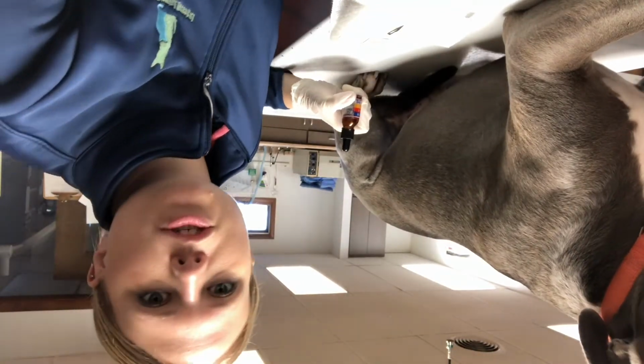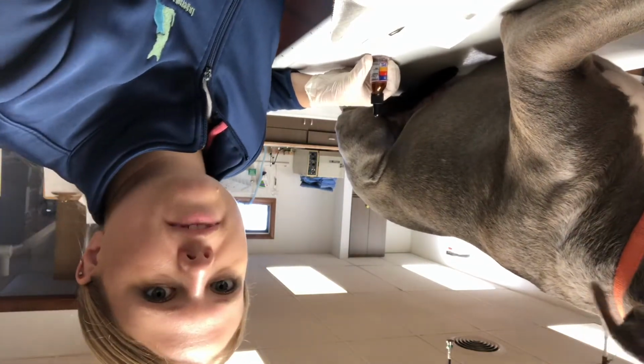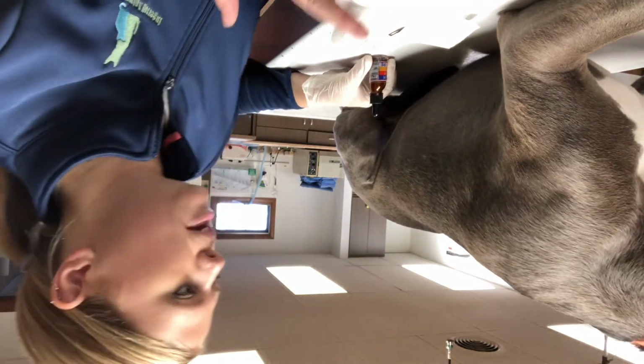And in this video, I'll be demonstrating how to perform an ear cytology, a skin scraping, and a vaginal cytology. We're going to perform a skin scraping, which is used to diagnose external parasites on the skin. We're going to use a location where we believe that the external parasites would be.